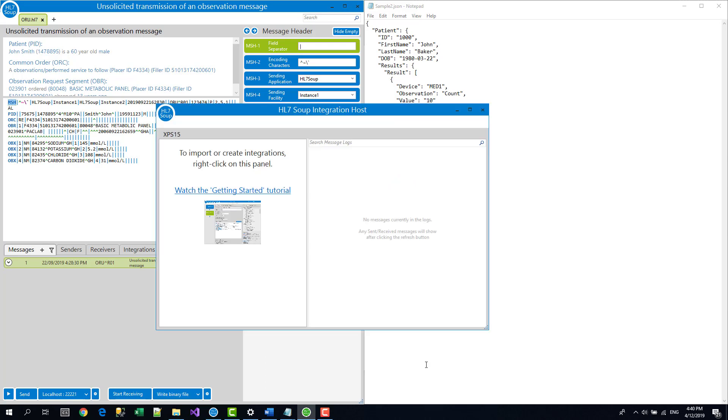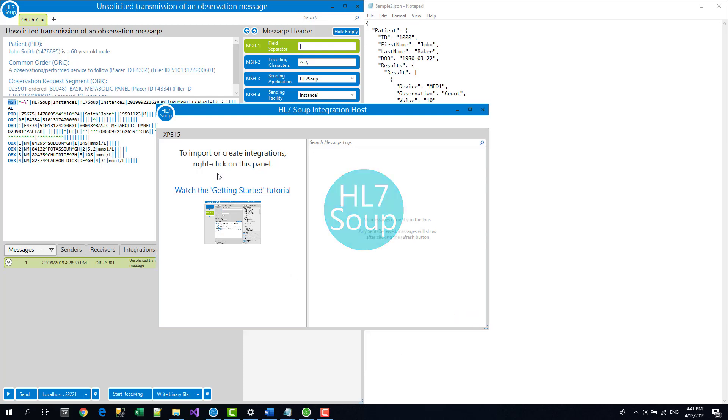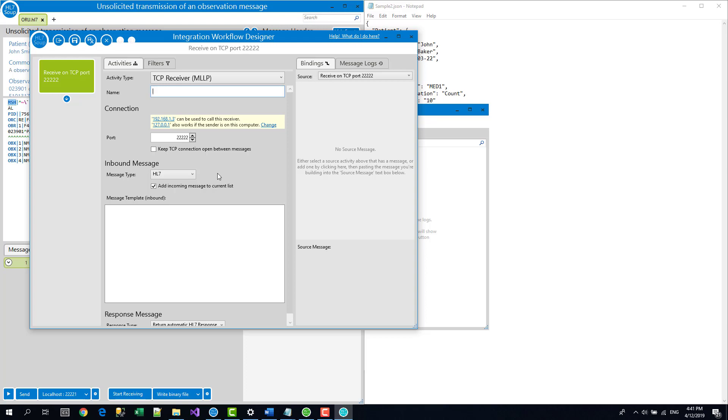So here it is. This is the integration host. The main screen is the dashboard used to monitor your conversions. But first we need to create a conversion. We just right click on the left hand panel and select new to load up the workflow designer and define our conversion.